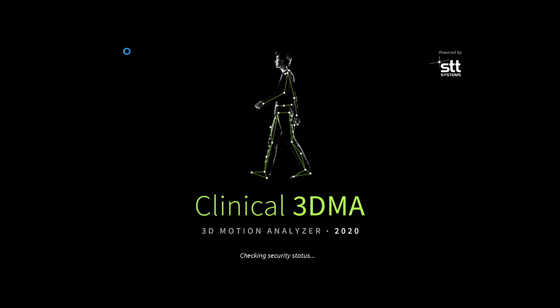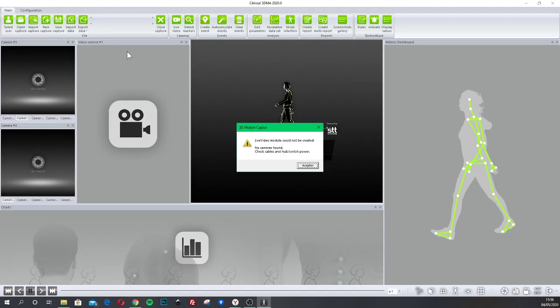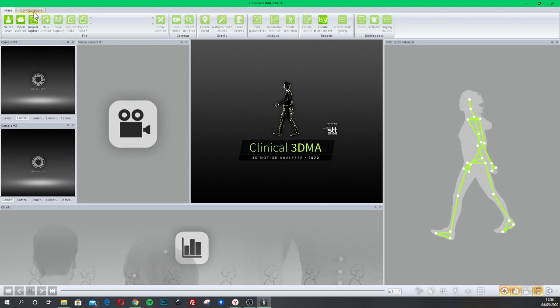So what we are doing now is opening a template. I will show you where all the templates from 3DMA are. We are making a copy of them, and then we can edit them with some tips and with some care. We need to be careful when we edit the templates. Okay, this message is because I don't have cameras plugged into my system at this moment. No problem, I can continue.